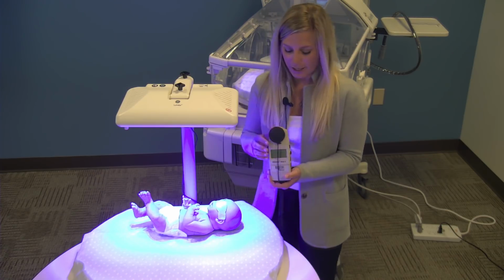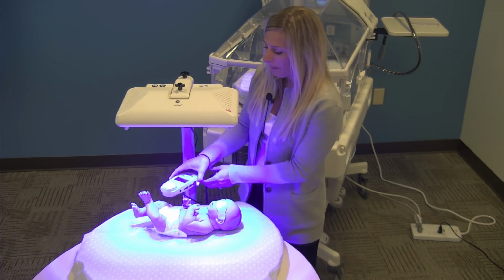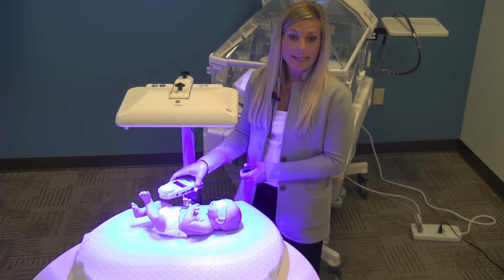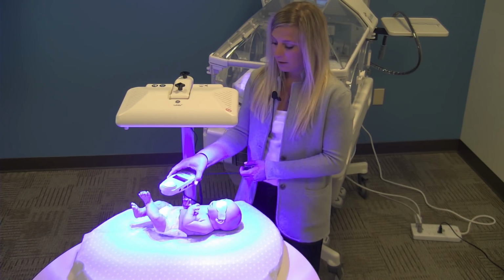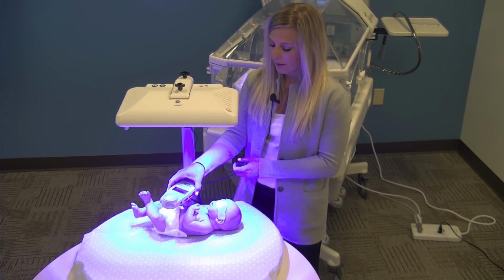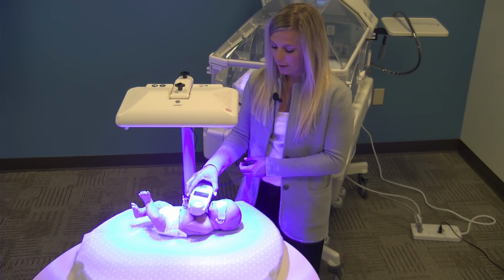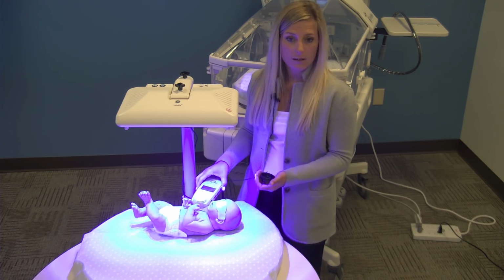So we've got our zeros here. Of course, I'm unlocked, and I will remove that cap. And I can get my first point, lock it in, jot that down, so 46.4. Press the circle button again to release, move over. So we got 30.7 on a lock. And I will release, and I will come over here. And I've got 39.2, release, and my fourth point, 50, release.